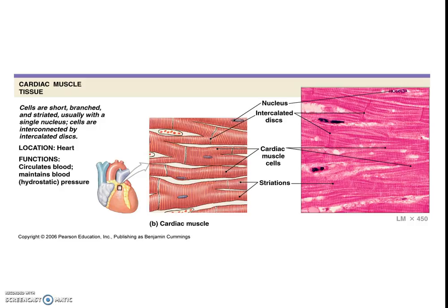But right now, we just need to be able to recognize this, and especially recognize these intercalated discs, that are important to how these muscles actually function. Again, we find this only in the heart, but it gives the heart a specific ability to actually beat 24 hours a day, 7 days a week, whereas we don't necessarily have to have that same ability in our other types of muscles.